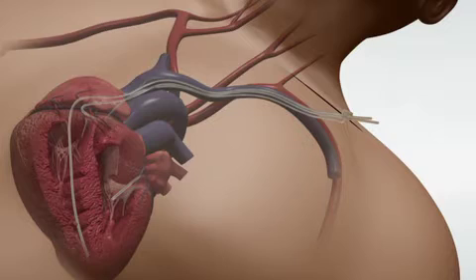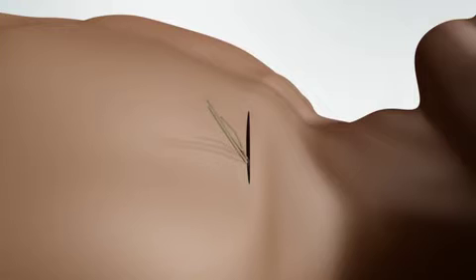Once the leads are in place, your doctor tests them to make sure they are in the best position to deliver energy to the heart. Your doctor then makes a pocket for the pulse generator just under the collarbone by separating the skin and underlying tissue from the muscle beneath the tissue.